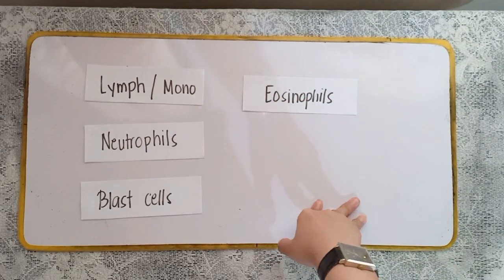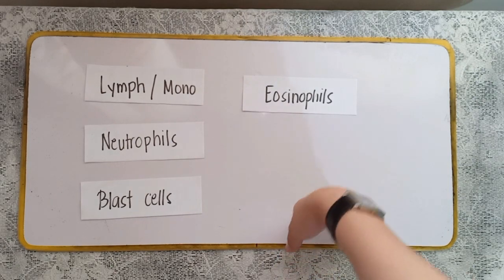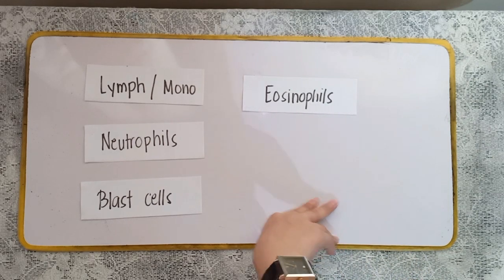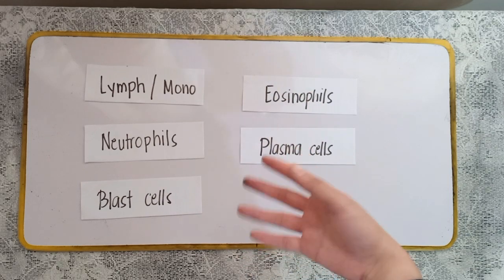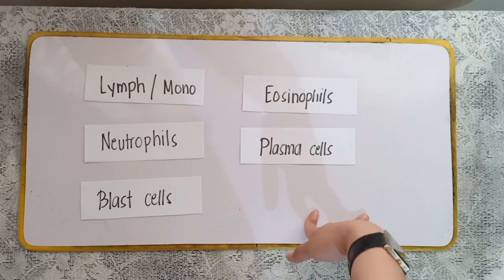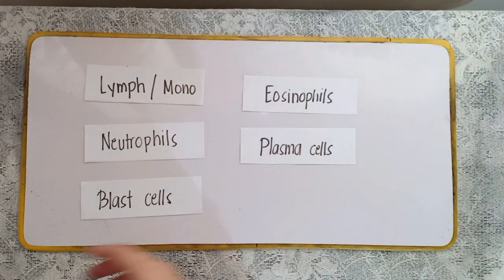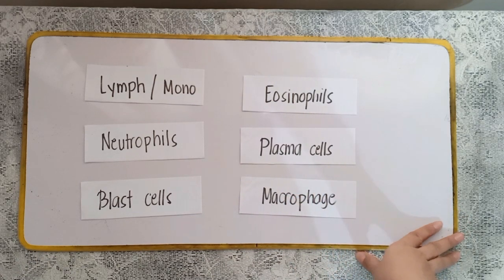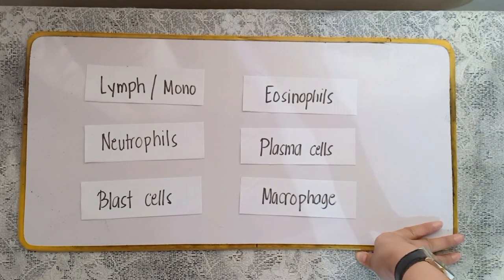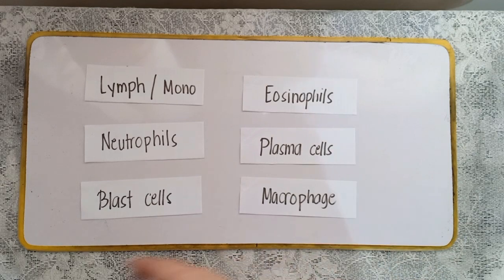Okay. And then next we have your eosinophils. An increase in eosinophils, dalawa lang yan. Pwedeng may parasitic or fungal infections. Okay, parasitic and fungal infections. And then next we have your plasma cells. The presence of plasma cells or an increase in plasma cells is an indication of multiple sclerosis as well as lymphocyte reactions. And then next we have your macrophage. Your macrophage, class, again, yung parang sinabi ko kanina, is an indication of a previous hemorrhage in the form of erythrophages. Okay, macrophage with ingested RBC.